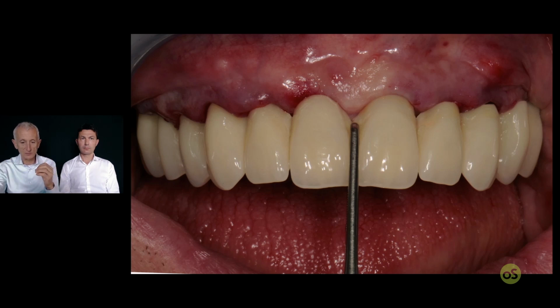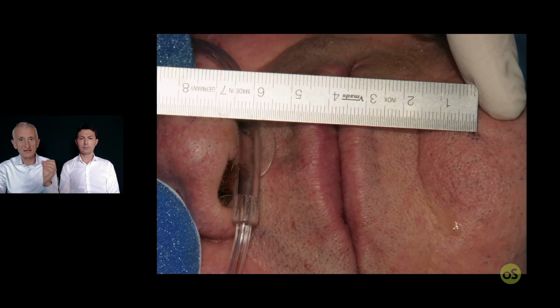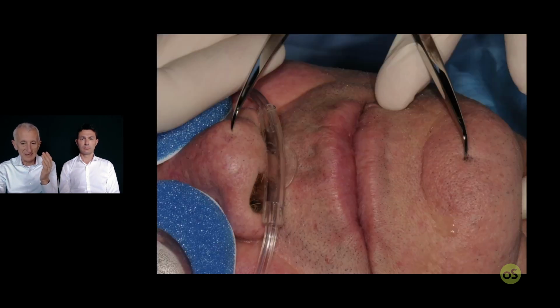Then you ask the patient to bite down very gently, okay, and you check again the same parameters, midline, vertical, and so on.